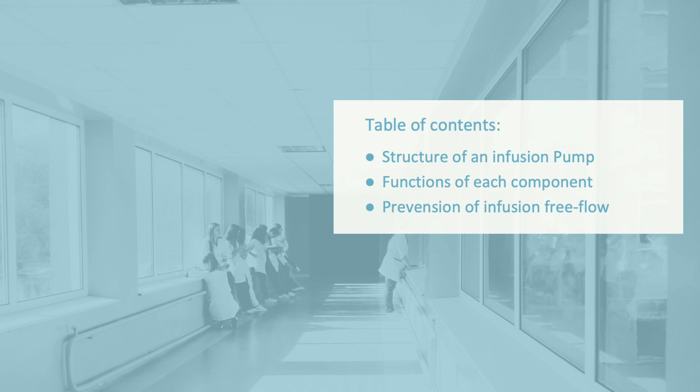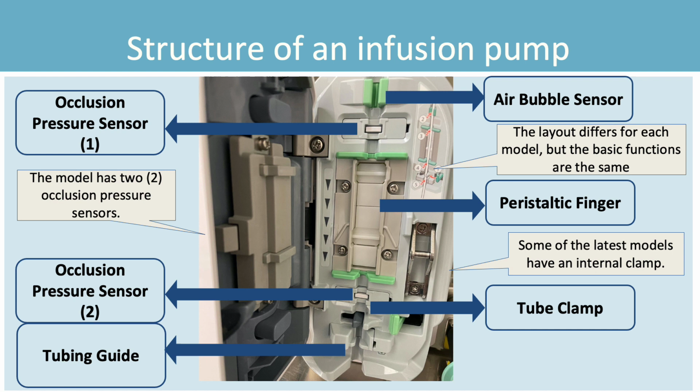This is the content of this lesson. The internal structure of the infusion pump is as shown in the picture. Although there are differences in the structure depending on the model, the basic functions are the same. Each of these basic functions will be explained in this lesson.